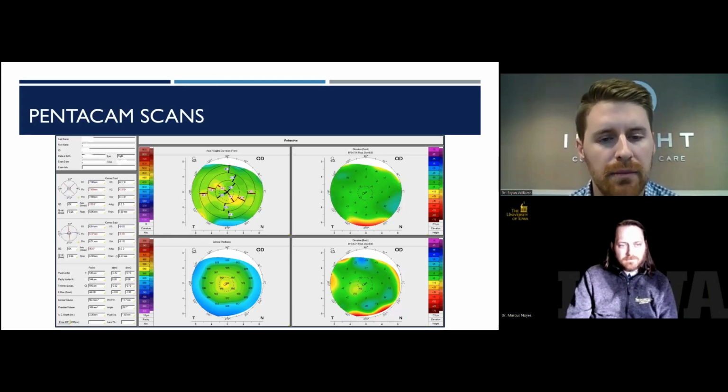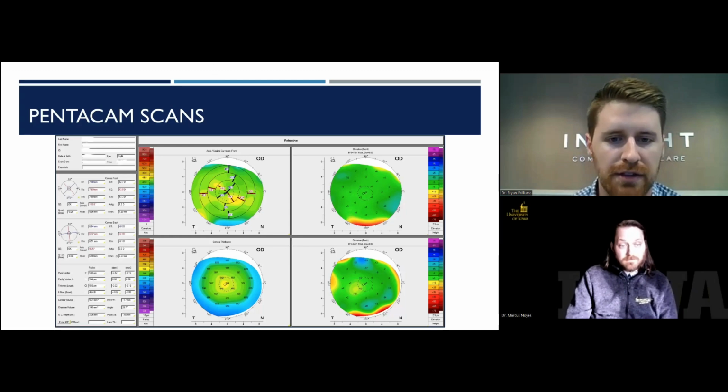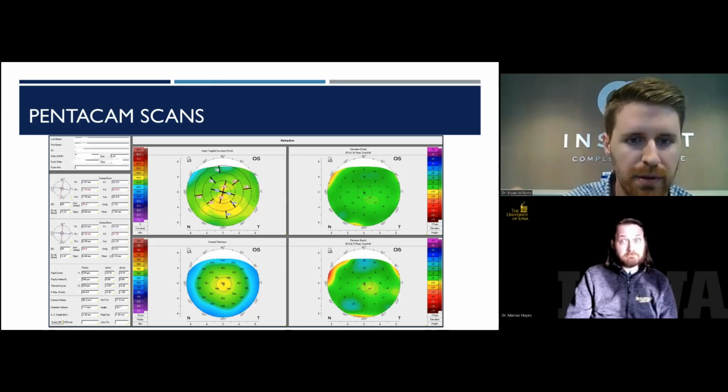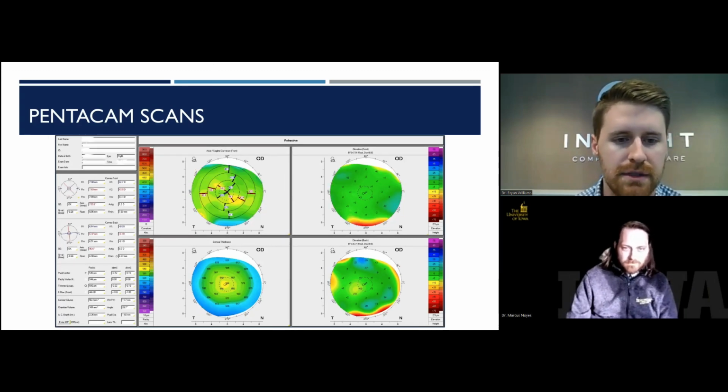Having a drop set or an artificial tears set right there at the Pentacam, and instilling some drops to try to smooth out that surface for these really severe ocular surface disease patients can sometimes get a little bit more quality scans. But you can tell that the inferior components of this cornea have that steepening, where they start to drop off a little bit.